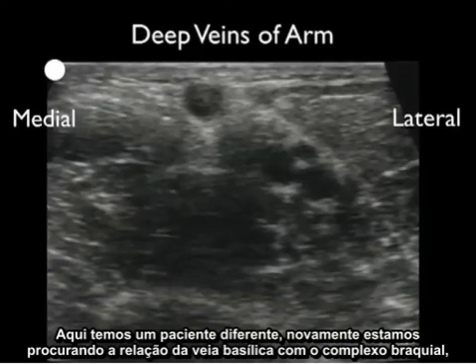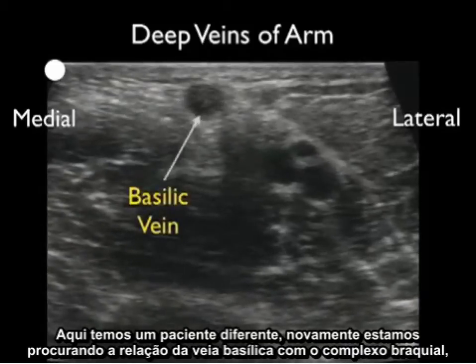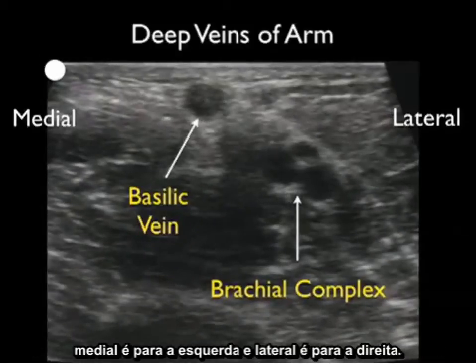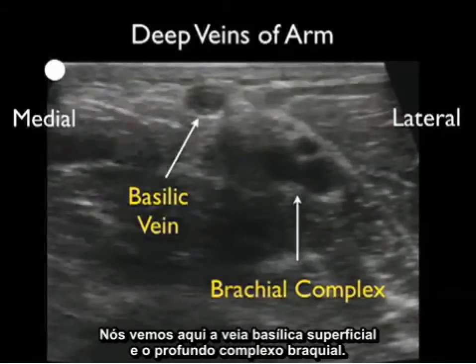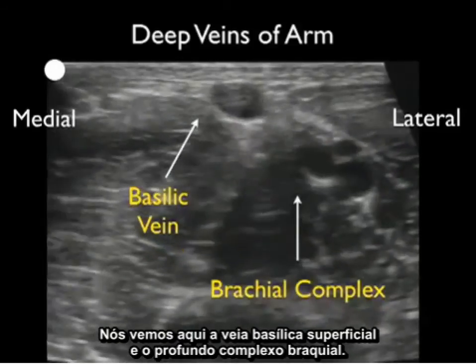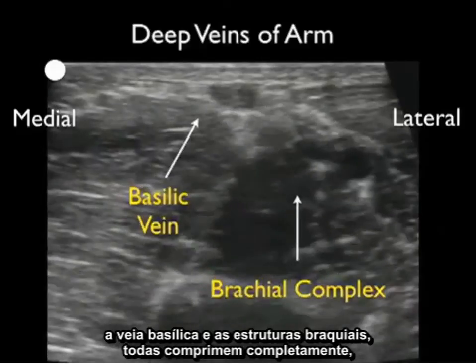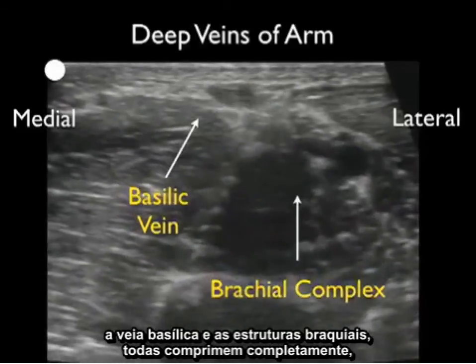Here's a different patient. Again, we're looking at the relation of the basilic vein to the brachial complex — medial is to the left and lateral is to the right. We see the superficial basilic vein and the deeper brachial complex. When we apply pressure, all of the venous structures — the basilic vein and the deep brachial veins — compress completely.